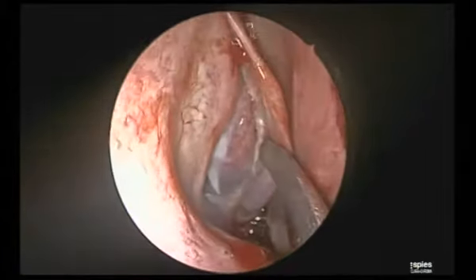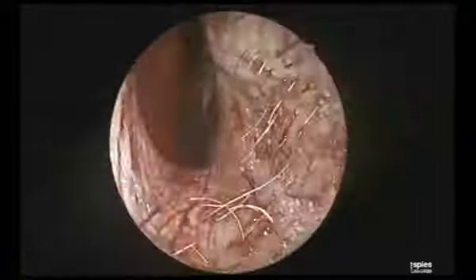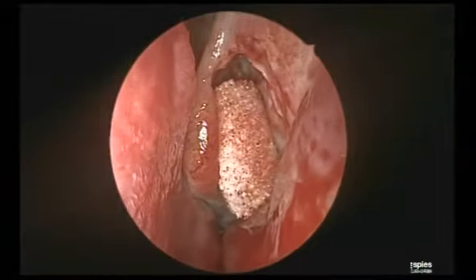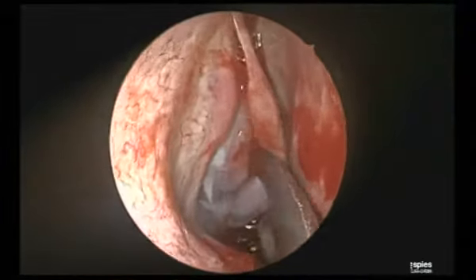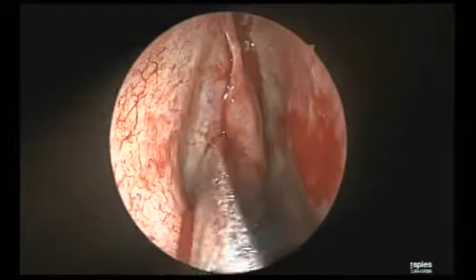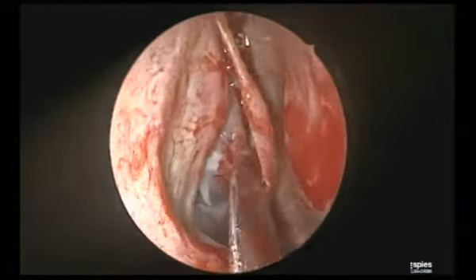Yeah. See, this is what I told you, to give this kind of access. See, on the other side, I want this access for the irrigation. And this floppy turbinate, if it doesn't give, I need to do something with this. That's what I told you. It is important in this particular case.